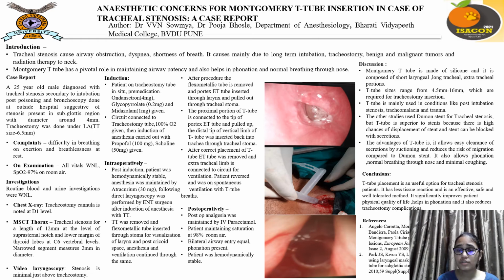First picture shows the tracheal stenosis which is present in the subglottic region, and this is the T-tube insertion. Second picture shows the insertion, and third picture shows after T-tube insertion.